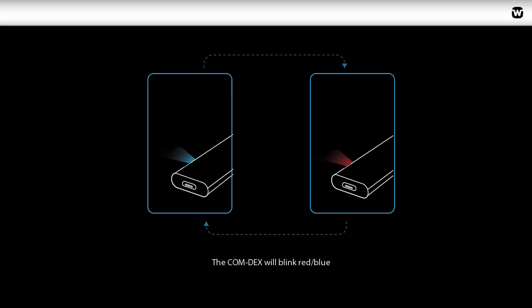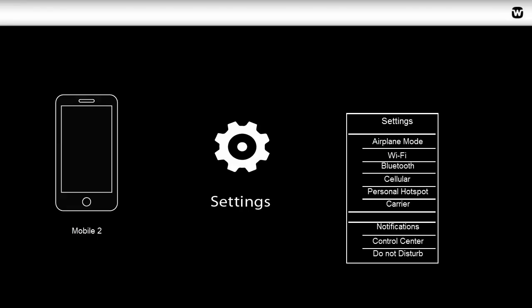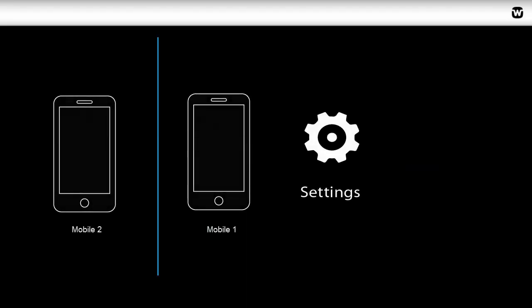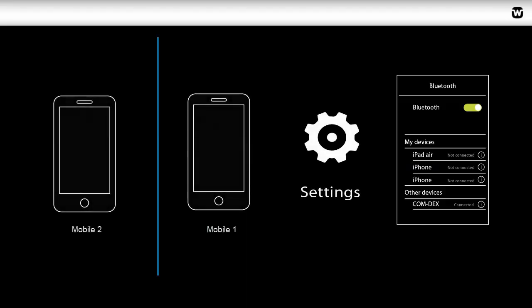Begin by closing the neck loop on the Comdex. The device will blink red and blue. On Mobile One, select Settings, Bluetooth, Scan, Pair with Comdex Device.